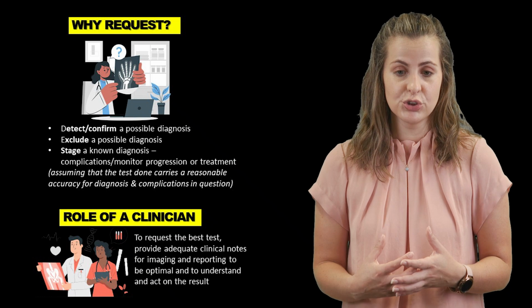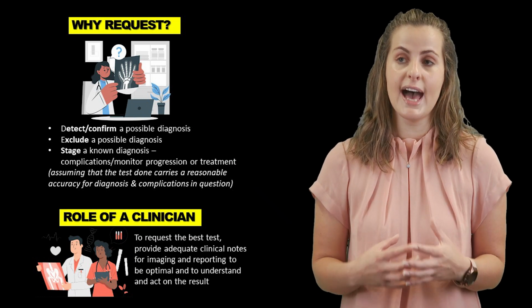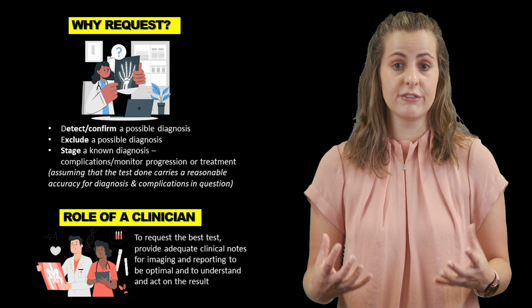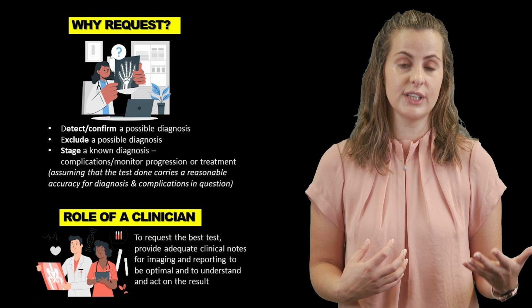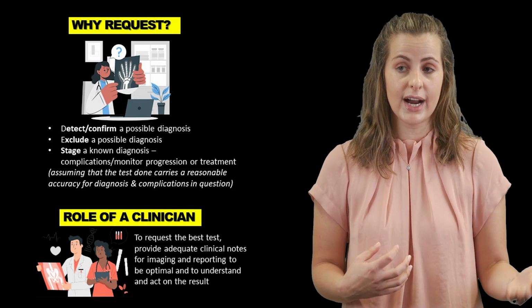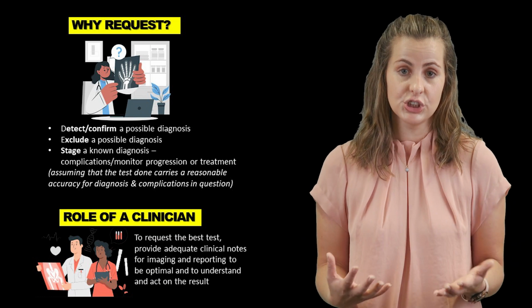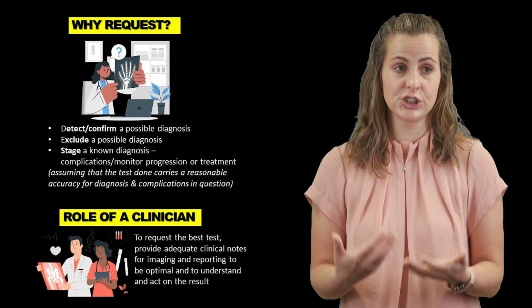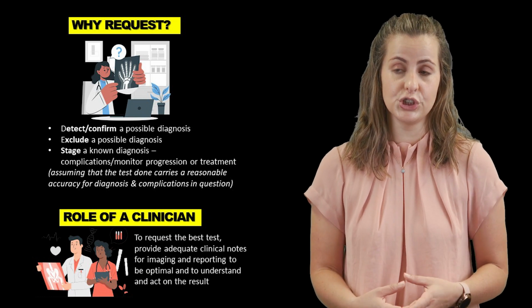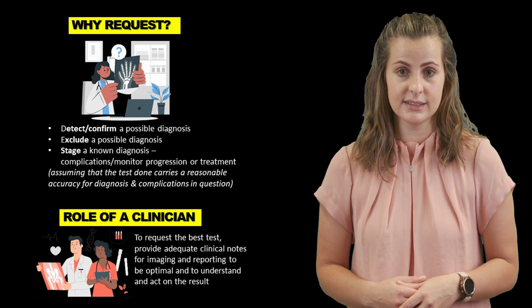You should also be able to understand and act upon the result. So therefore, having a well-rounded knowledge and familiarity with radiographic appearance and some of the language that we use to describe common injuries, common trauma, or other pathologies that you might see is going to be really important for you to actually be able to understand the radiology report, but also to verify or validate if required.